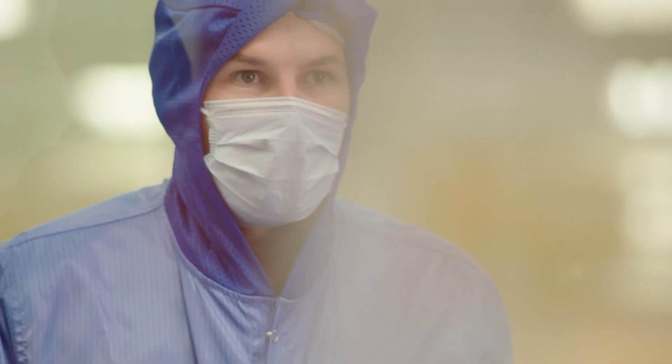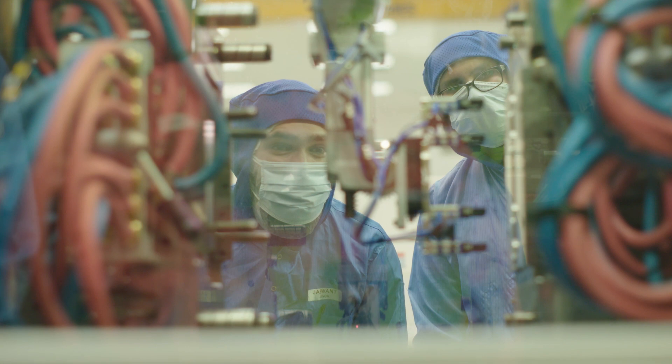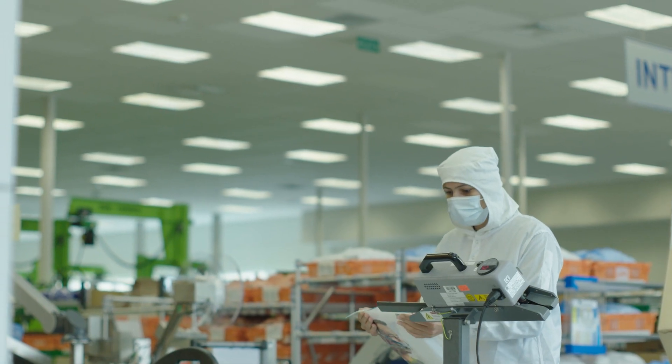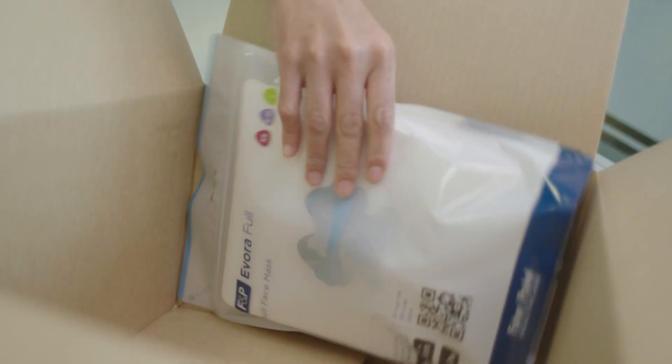We work with suppliers all across the world looking for the best manufacturing equipment we can get. We have an ultrasonic welding process integrated with leak testing on the frame assembly, ensuring that 100% of the frames are tested. With a product like Evora Full that's optically critical to get those nice clear products, we use robots to remove the parts from the mold tools and avoid scratches. What we're looking to do is make the same product over and over again as consistently as possible so the user experience is the same for all.